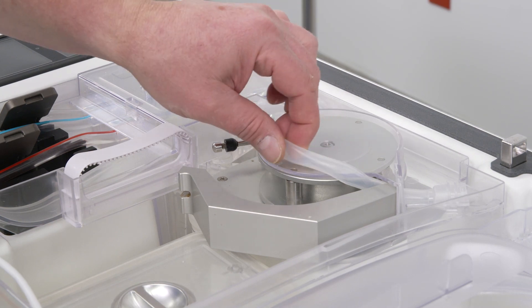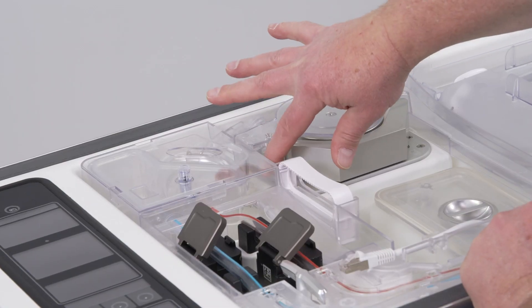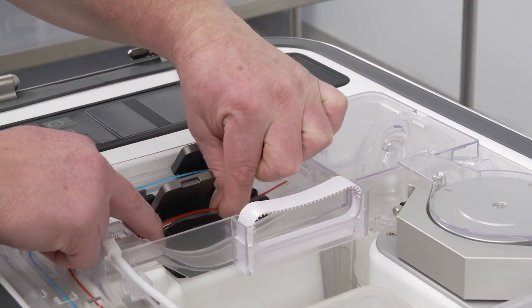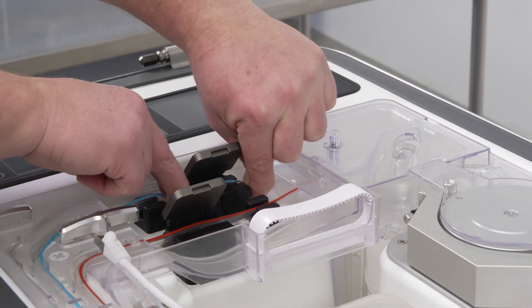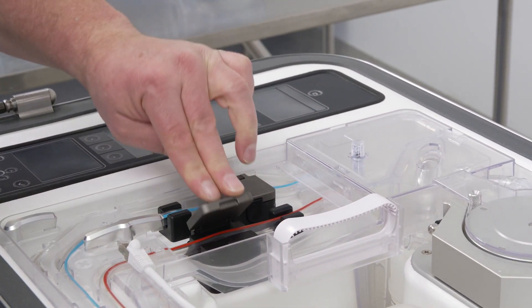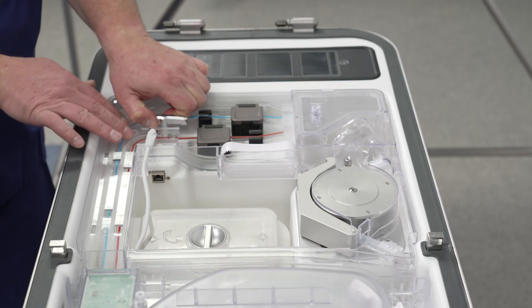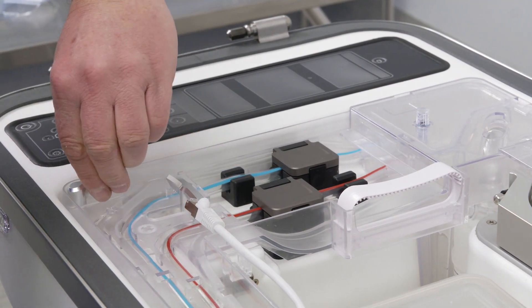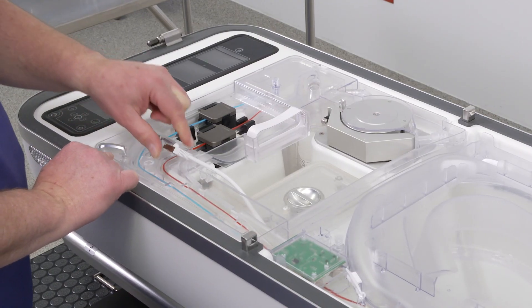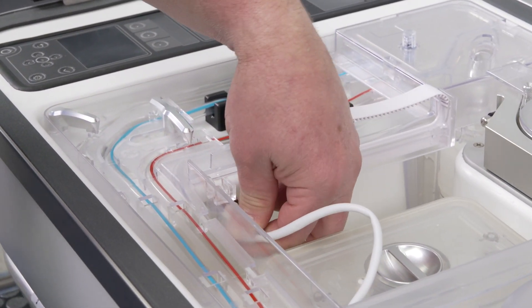Stretch the pump tubing loop over the infusion pump. Close and latch the pump head raceway. Slightly stretch the tubing lines while pressing them into the bubble detectors and ultrasonic flow sensors. Close the ultrasonic flow sensor doors. Rotate the pump deck locking arm 90 degrees counterclockwise and the vent locking arm 45 degrees clockwise until they click into place. Connect the pressure sensor cable to the pressure sensor connector on the pump deck.